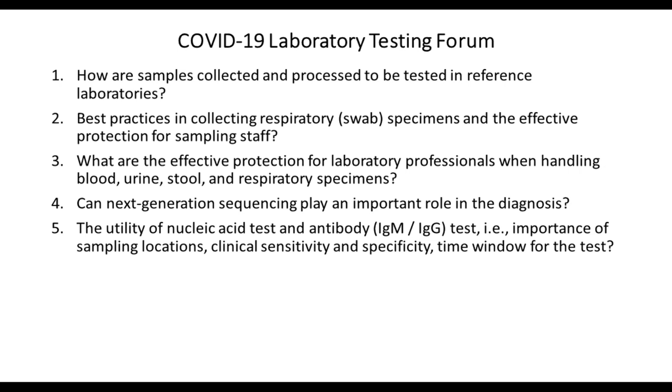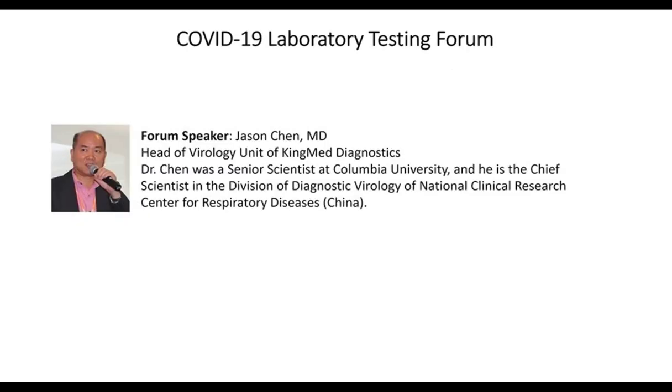Yes, I prefer the quantitative assay. However, right now the chemiluminescence methods from 2 different companies that we have used are both qualitative only, not quantitative. Technically, it should not be difficult to quantify them with chemiluminescence, but I don't know why they have been used so far for qualitative only. Probably it's easier to get approved by CFDA. I'm not sure.